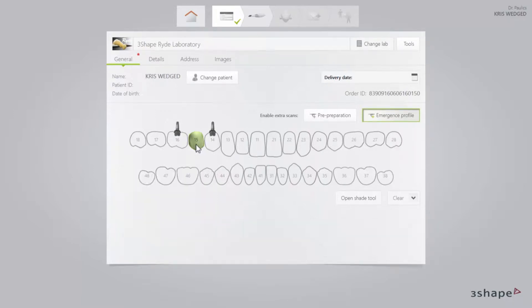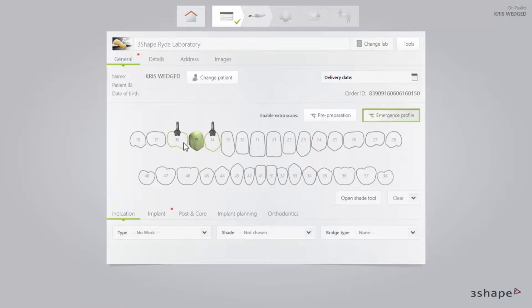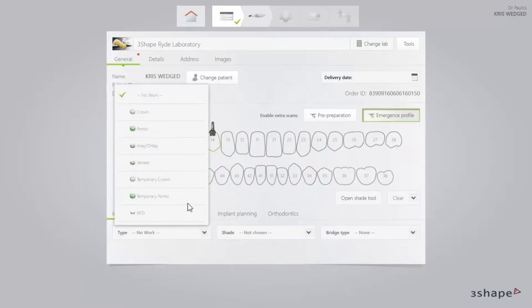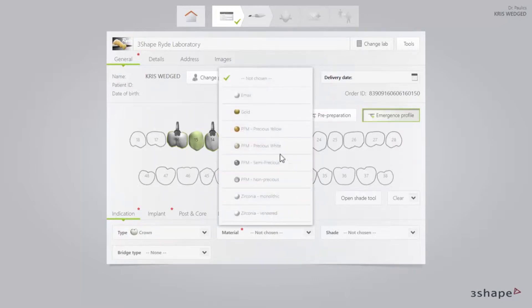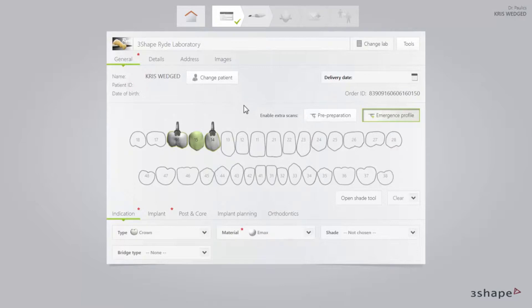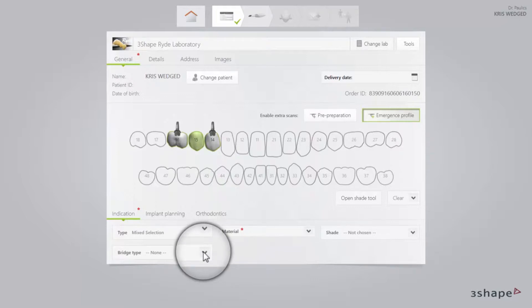When ready, deselect Pontic and choose the teeth with implants again. Add a crown on top of the implant by selecting Indications and then Type of Crown Material. Finally, make sure that you have marked all the teeth comprising the bridge. All the teeth in the bridge will now have a green outline. Select the bridge type on the bridge type drop-down list.